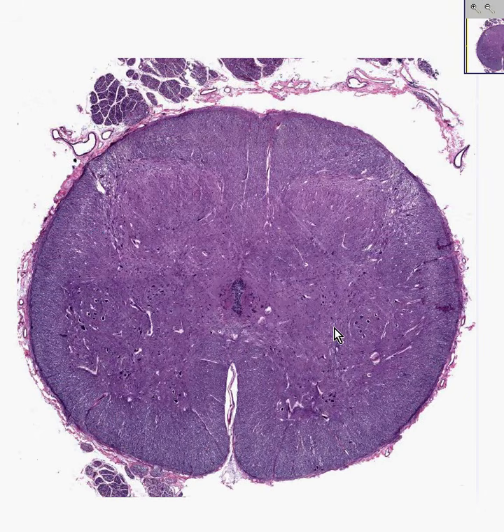Just like we saw in the central nervous system of the brain, we had large cells called neurons, and we had small cells called glial cells. And then we had vascular spaces, membranous, loose connective tissue, and very, very vascular tissue called arachnoid mater. And then we had a couple tiny little cells just covering the surface of the central nervous system called pia, which we may find in here. But all of this is arachnoid, all of this is arachnoid.